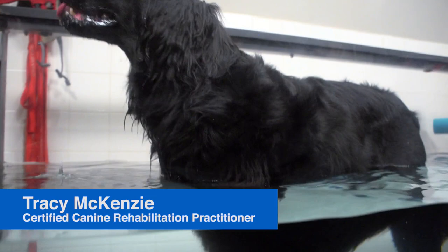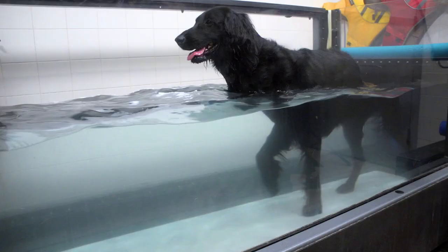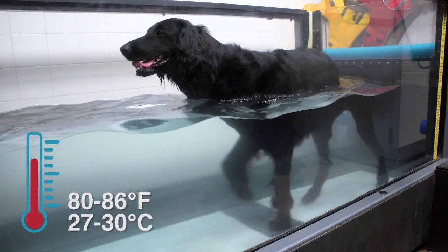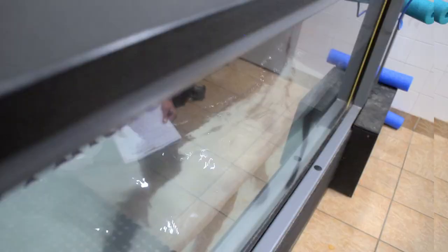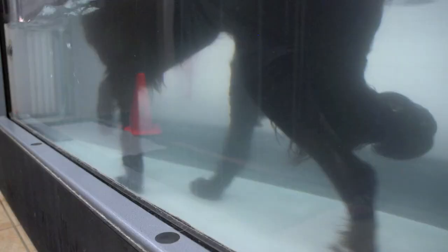Hydrotherapy will speed the recovery process in that the buoyancy of the water allows them to exercise for longer distances and faster speeds without putting stress on the injury or surgical repair. It takes about double the effort to move through water than it does through air, so that's where she's getting the strengthening from the resistance of the water. And then the warmth of the water relaxes and soothes all of the tissues that are submerged. And it feels good.